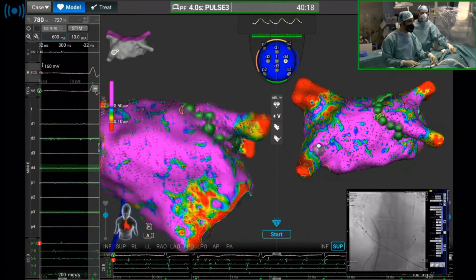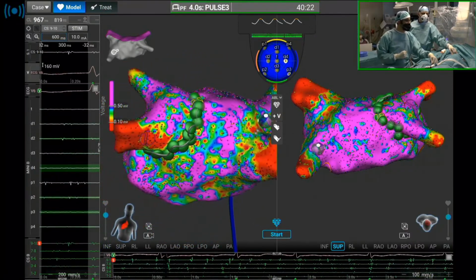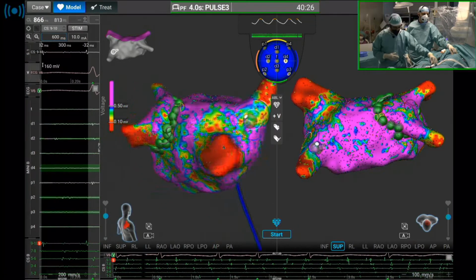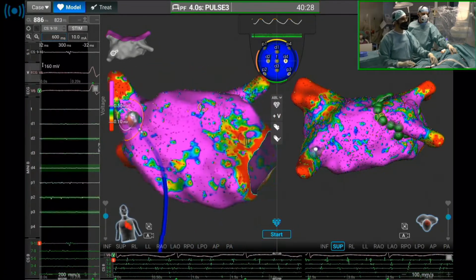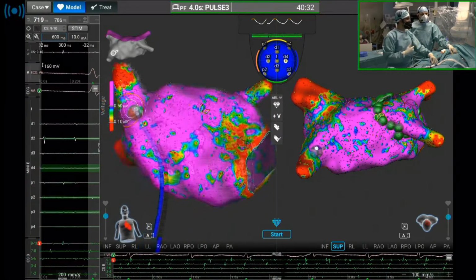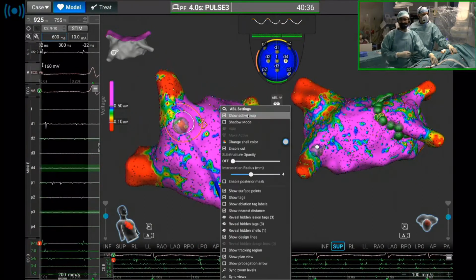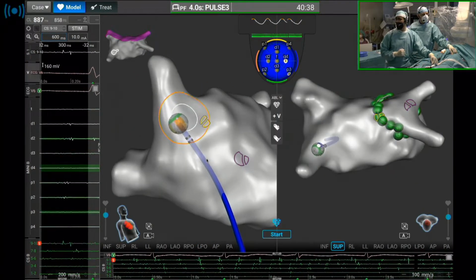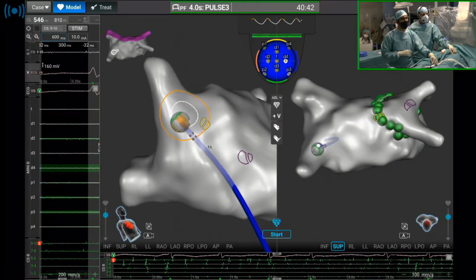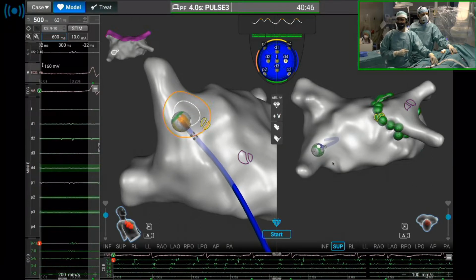The left-sided veins, the isolation took 7.5 minutes, and we had an entrance block. We obviously have not checked for exit block because the patient is still in AF. And our plan for this patient is to isolate the right veins, and then we'll do a posterior wall isolation. We'll do a roof line and another line at the lower level of the veins, which will be a box posterior wall isolation.